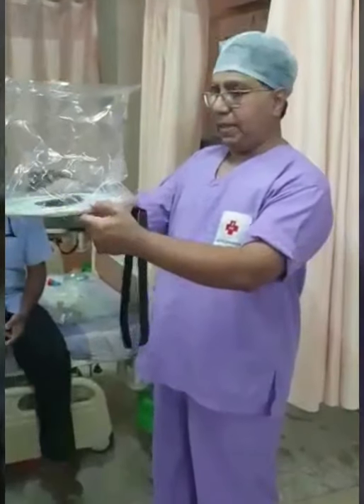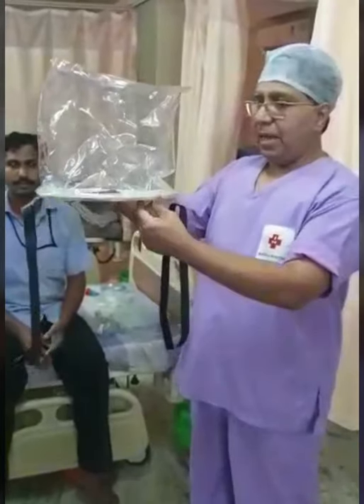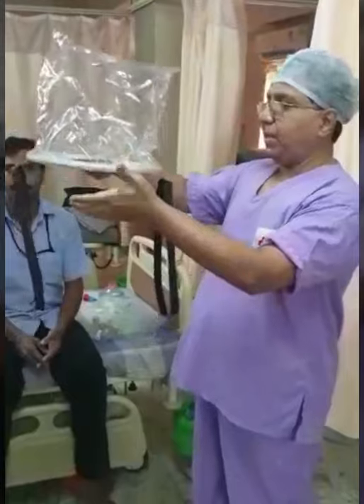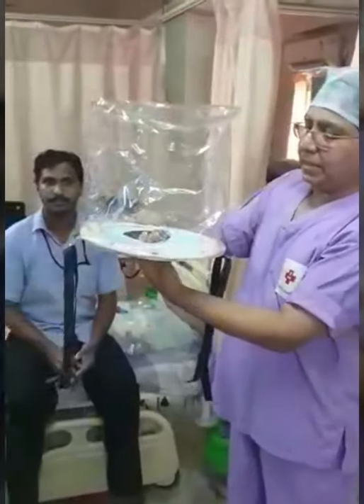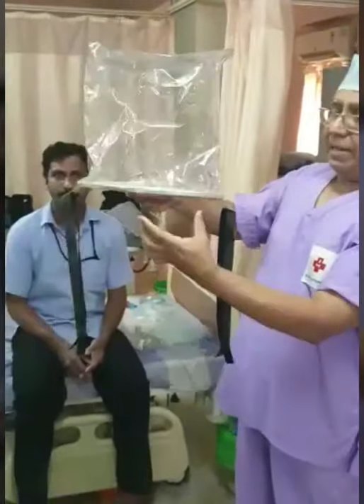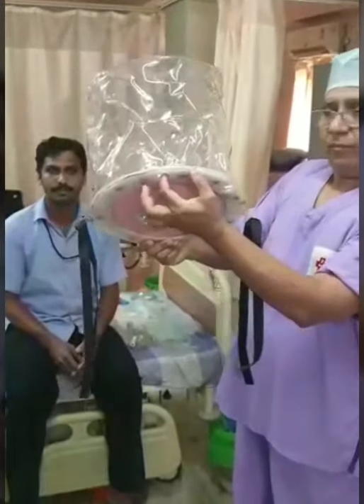This is a typical oxygen bubble hood which we have been using on COVID patients. I would like to explain how this has to be used effectively. This is the hood — this is the transparent hood over it. This is a rubber sheet which fits onto the neck of the patient. These are the two rings which fold them, and these are two ports: one for inlet and one for exhaust.